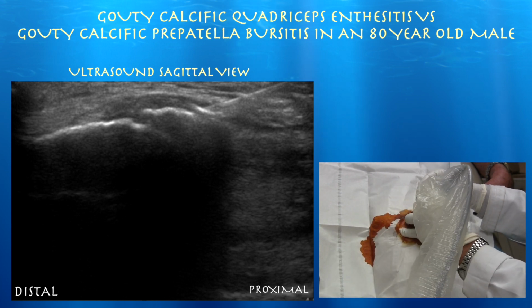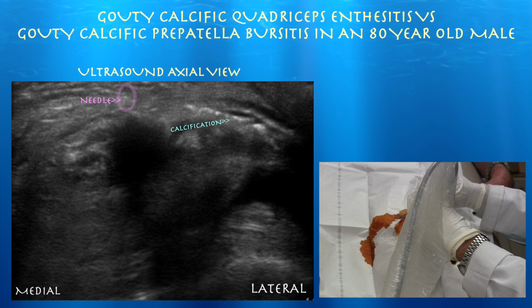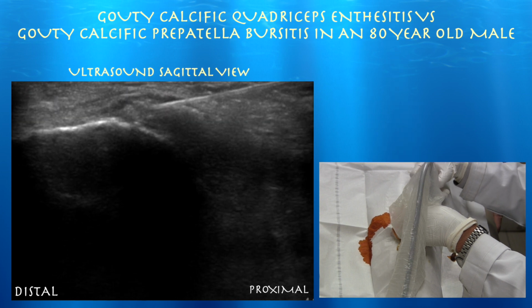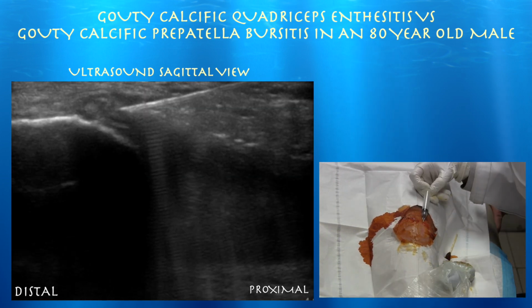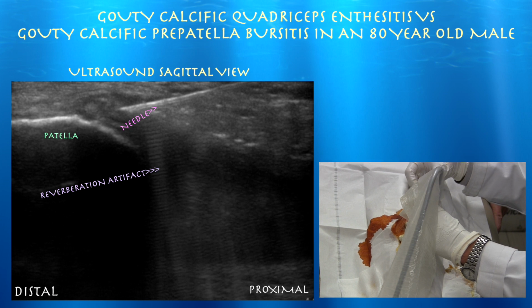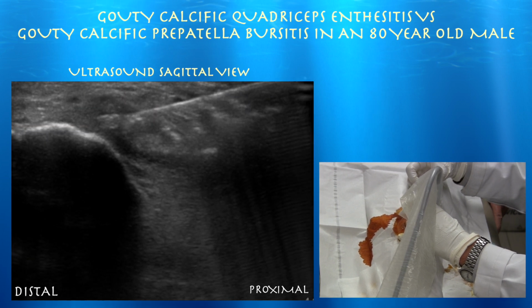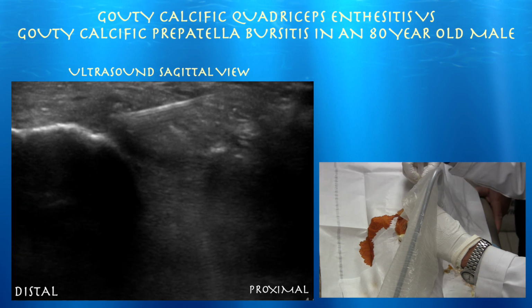Going to do an axial view now. Probably better to do this part while he's numb from the lidocaine before you dilute it with saline. This is a sterile drape, sterile gel. I need a sterile gauze. Here's some saline. Maybe just flush it out. Maybe take some saline into it. You're just going to feel a little grittiness to it, and that's all that calcium.